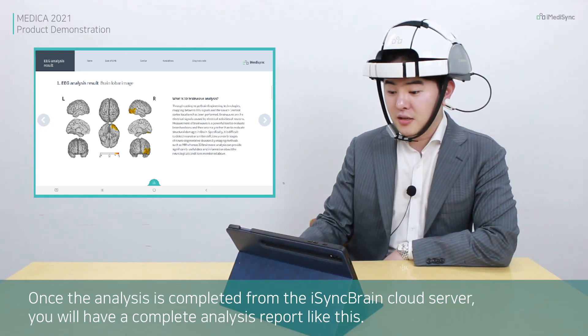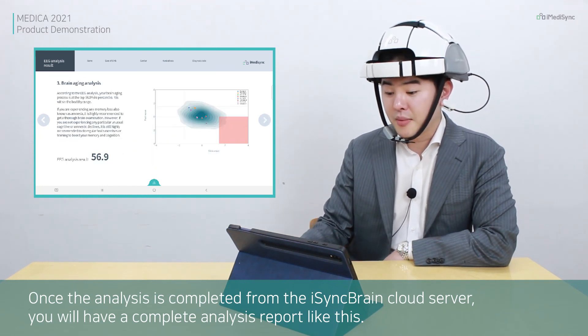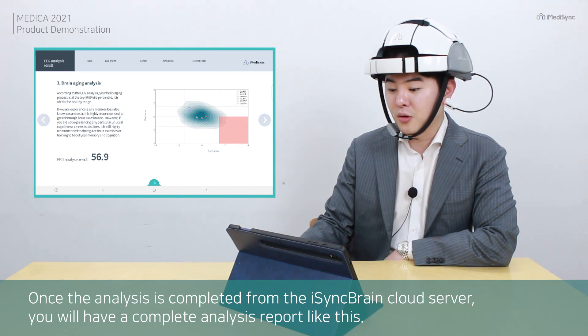Once the analysis is completed from the iSync Brain Cloud Server, you will have a complete analysis report like this.